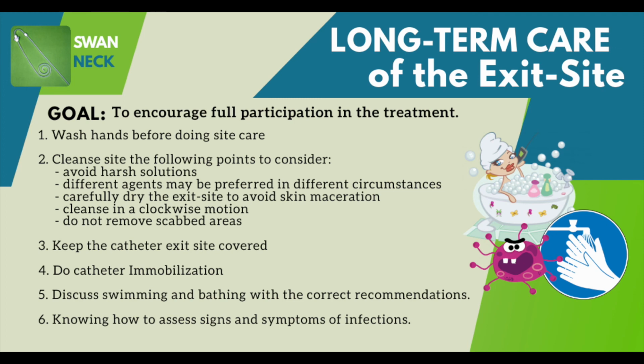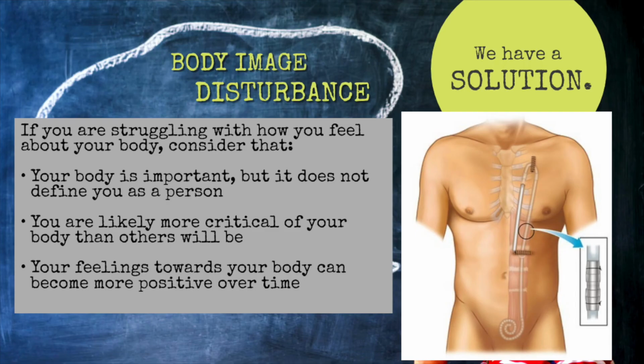Assess for signs and symptoms of infections such as pain/tenderness, redness, drainage, crusting. There are many psychosocial challenges involved as patients adapt to PD. As nurses, it is important to discuss in detail these concerns to prevent any complications.